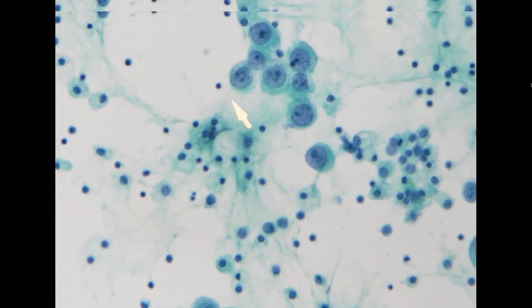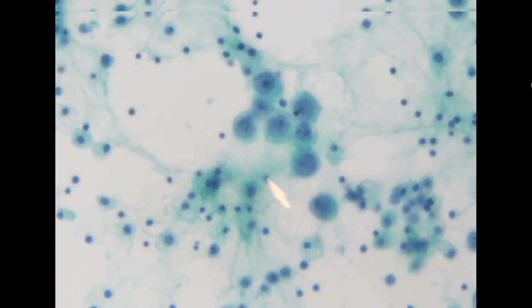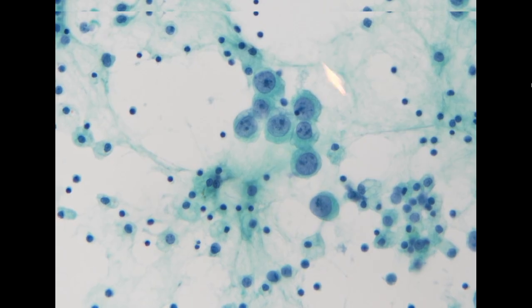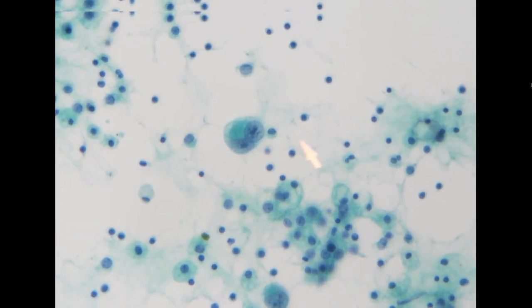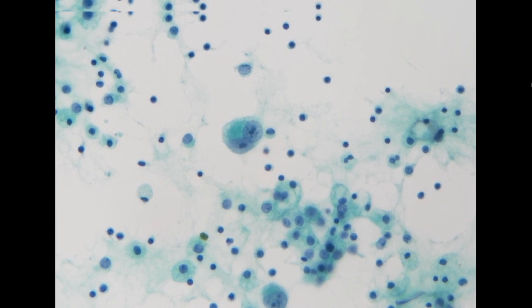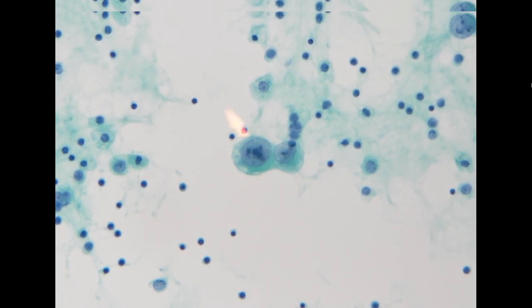So sometimes a poorly differentiated adenocarcinoma can look like reactive mesothelial cells, but the size of the nucleus and the prominent nucleoli are features that you won't see in reactive mesothelial cells. So again, these are consistent with recurrence, given the patient's known history of primary lung adenocarcinoma. So these specimens are positive for metastatic adenocarcinoma.